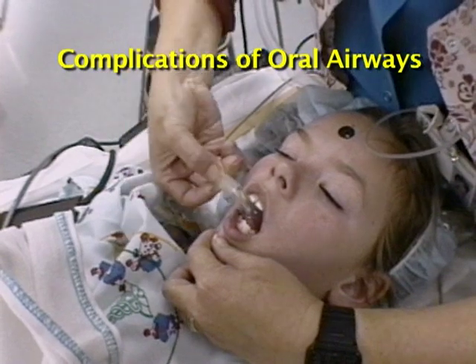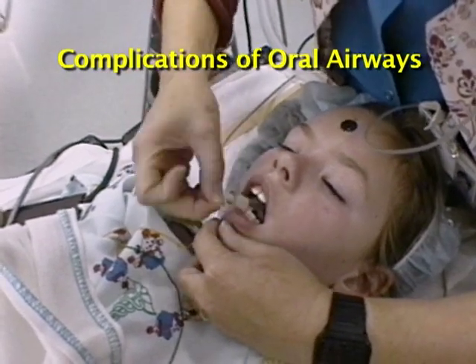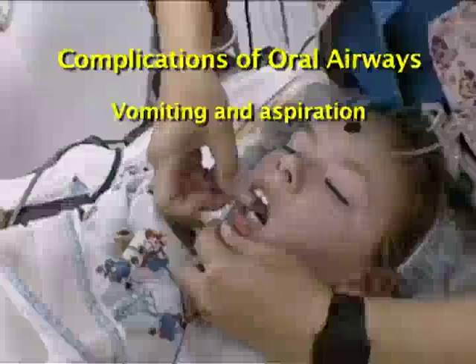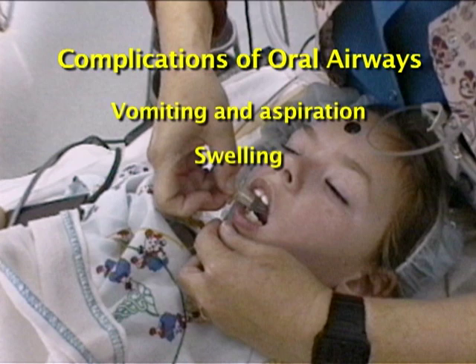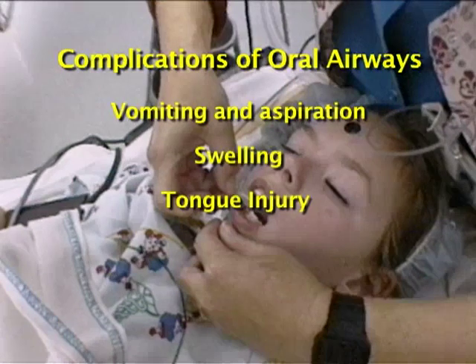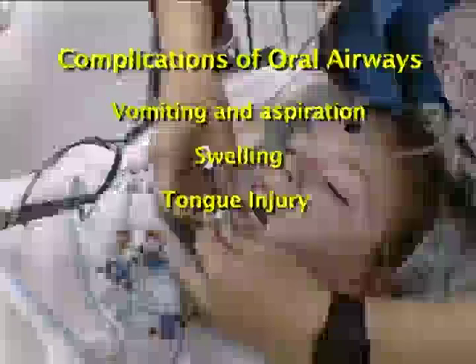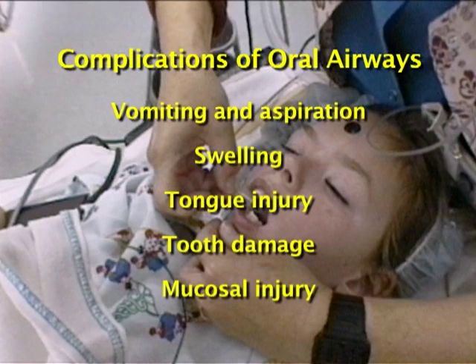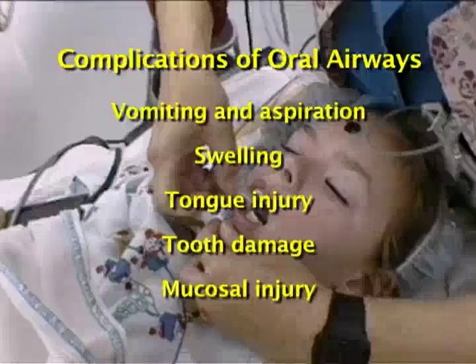Oral airways have risks when used in conscious and semi-conscious patients. Risks include stimulating the gag reflex and causing vomiting and aspiration. Compression of lingual vessels and nerves can cause swelling. In addition, the tip of the tongue can get pinched between the oral airway and the lower teeth, producing bleeding or edema. Use caution to avoid tooth damage or mucosal injury.